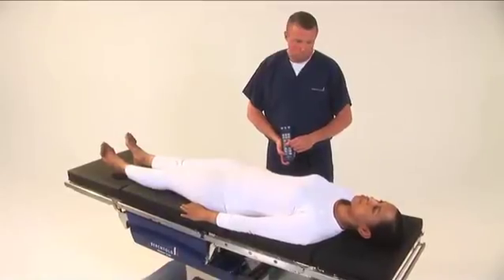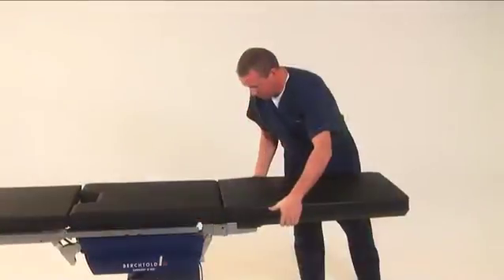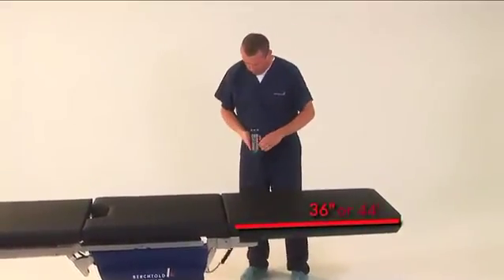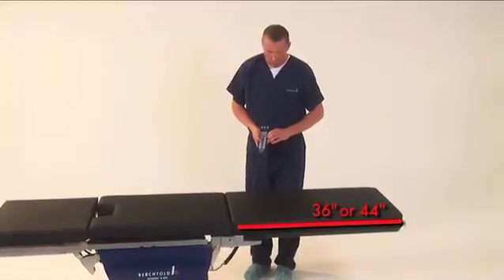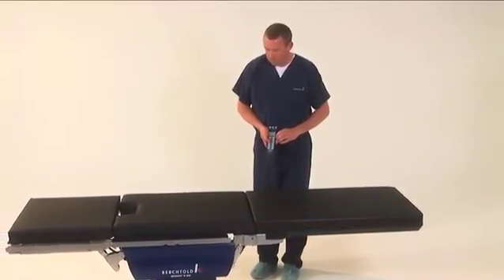For upper body imaging, use the hand pendant to slide the table toward the head. If additional imaging area is required, a 36 and 44-inch imaging extension is available. This extension replaces the head and back section.